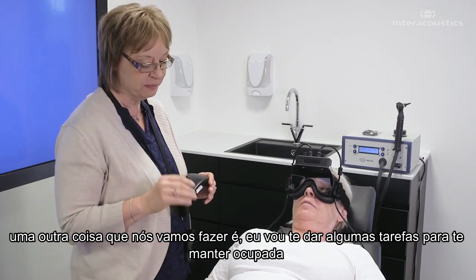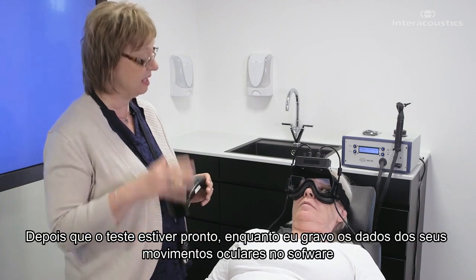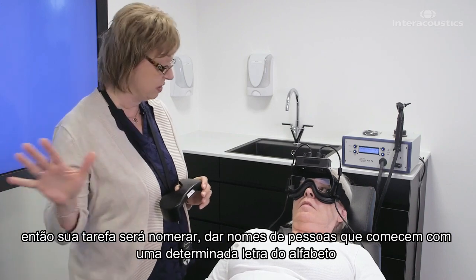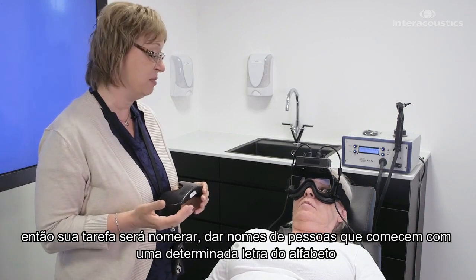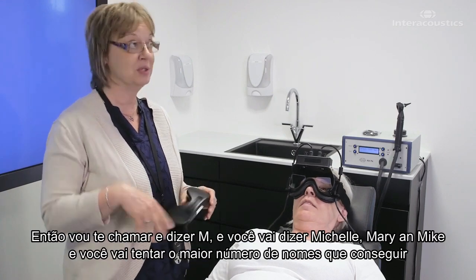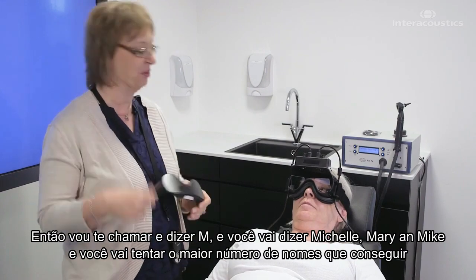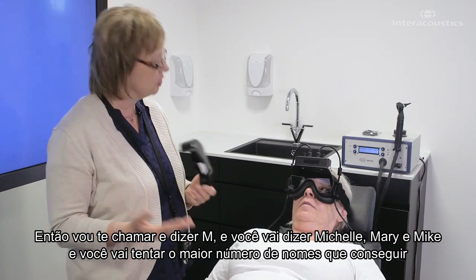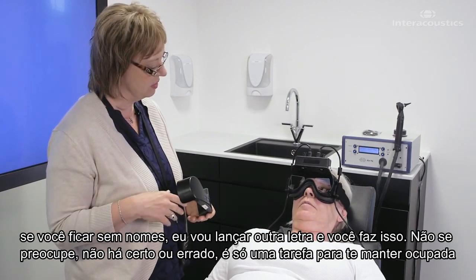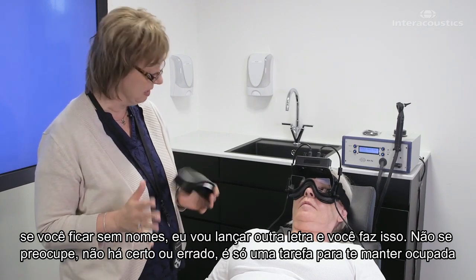One other thing we're going to do is I'm going to give you a task. I'm going to keep you busy after the test is done while I'm recording the data on your eye movements on the software. Your task is going to be that you're going to name people's names that start with a certain letter of the alphabet. So I'm going to call out, say, M, and you're going to say Michelle, Mary, and Mike, and you're going to try to name as many names as you can. If you run out of names, I'll throw another letter out. There's no right or wrong answer — that's just a task to help keep you busy.